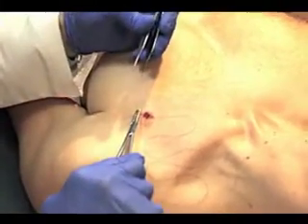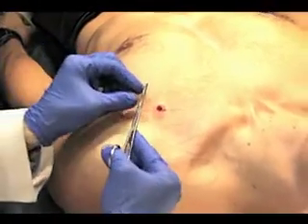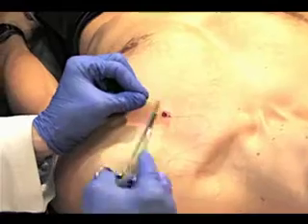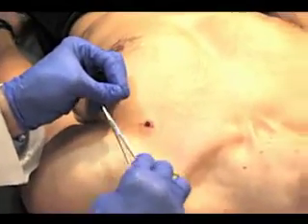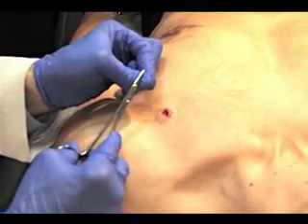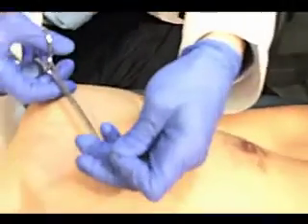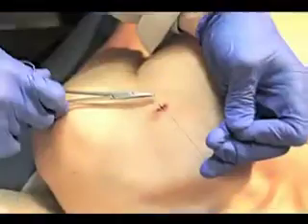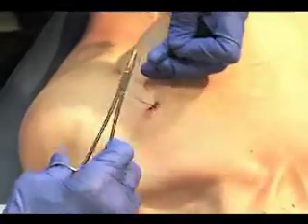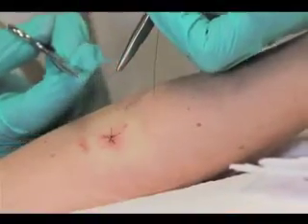When the suture emerges from the skin, grab the point with your palm down, handing the blunt end of the needle to your index finger and thumb. Circle the suture around the needle driver twice, then rest the driver on your thumbnail to prevent the suture from slipping. Pull up on the thread until the free end of the suture is short, and secure it with the needle driver. Next, spool the suture. Secure the first part of the knot, blotting any bleeding when necessary. Circle the suture in the opposite direction once and cinch a square knot. Repeat these steps for a total of three times, then cut the suture at about one centimeter.